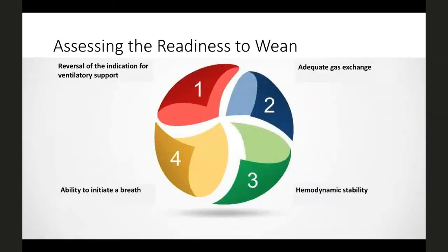First, the reversal of the indication for ventilatory support. There should be good enough reasons to believe so. The gas exchange should be adequate with indicators like good PaO2, reduction in FiO2 or oxygen requirement, reduction in PEEP requirement, the pH coming close to the physiological one, Vd by Vt less than 60%, patient not hyperventilating, etc.